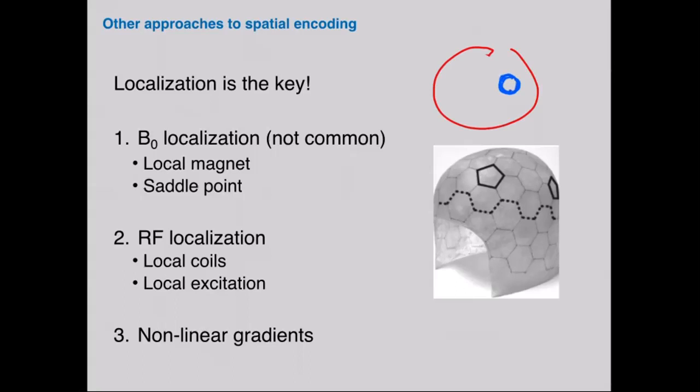And then what you could do is apply gradient fields in order to move this kind of uniform field into other places with electromagnets that you apply. And then this is almost like line scanning. Okay, so if you move a uniform field throughout the volume, then whenever it's non-uniform, you're not going to get a contribution. But where it's uniform, you're going to get a contribution of signal.